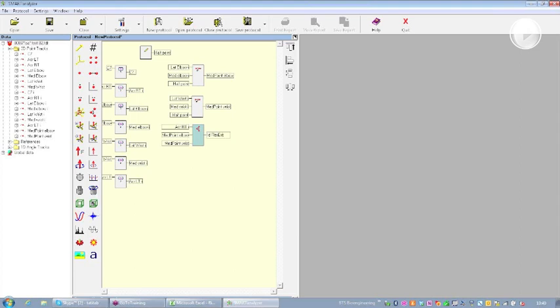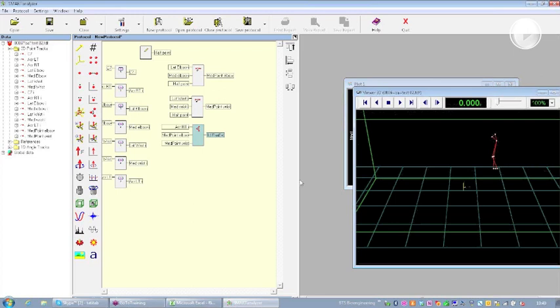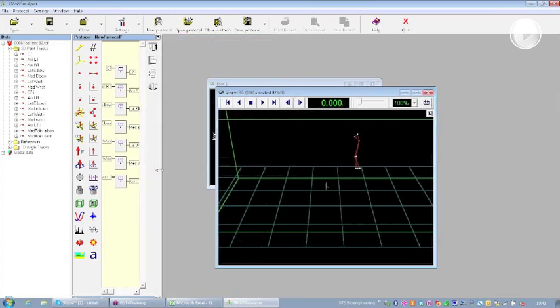Oh, sorry, I typed it wrong. 1D. This is going to be my flexion extension angle during the movement of the flexion extension of the elbow. Okay, remember that we start the acquisition. Let me show you all together these two elements.